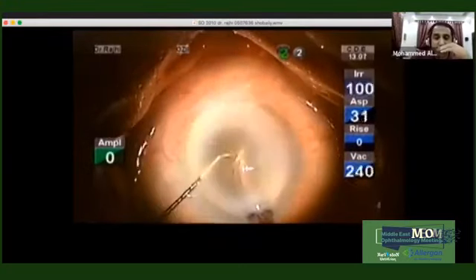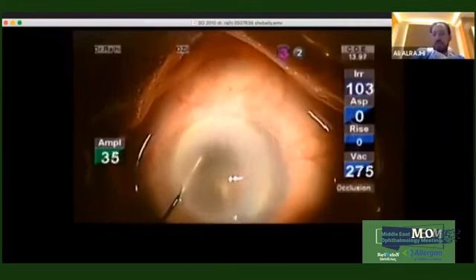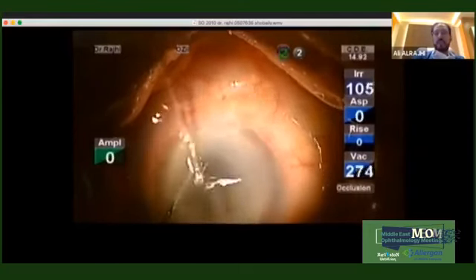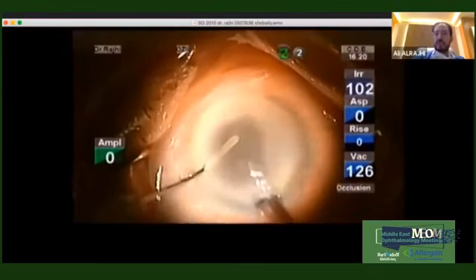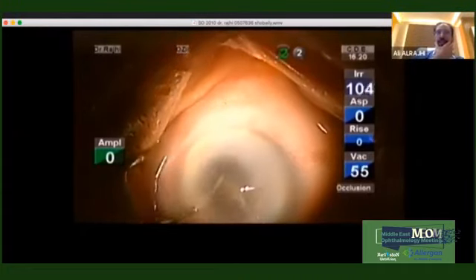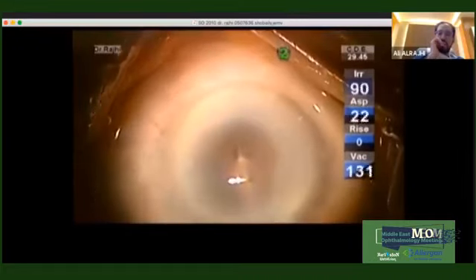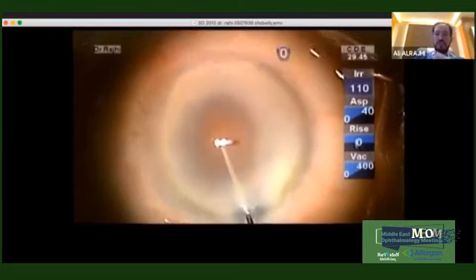Dr. Ali, is there any precaution you have to take in this case? Sometimes it's important to get the pupil dilated, and even side illumination is helpful. Sometimes using the intraocular illumination sideways enhances the capsulorhexis. And with, for example, the Lumera 700 Zeiss microscope, you can reduce the light and have a better red reflex with this hazy cornea. You can see the red reflex is obvious now.